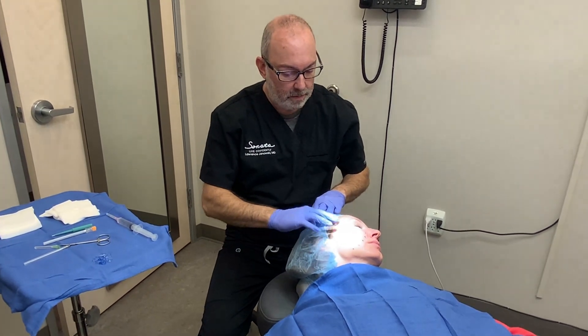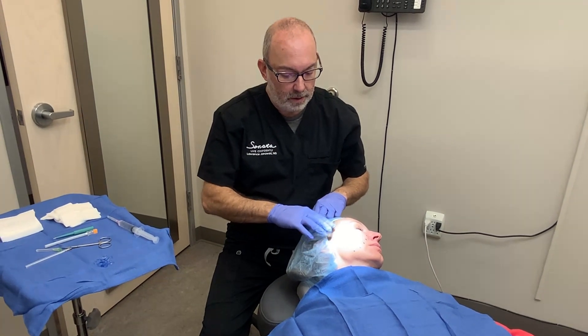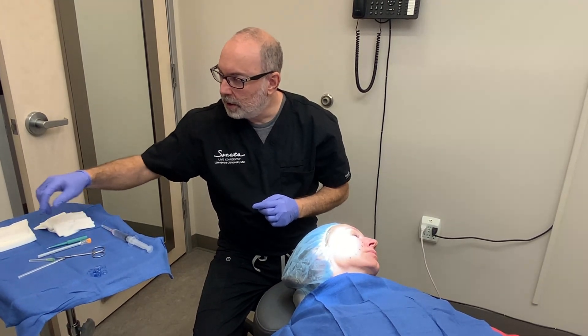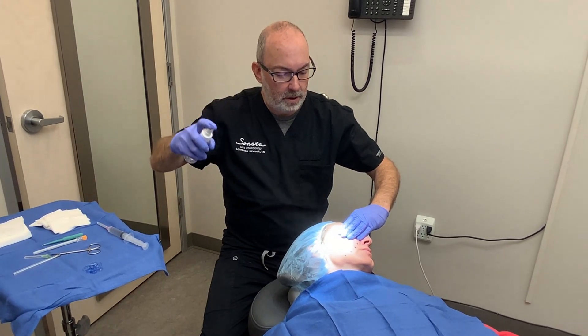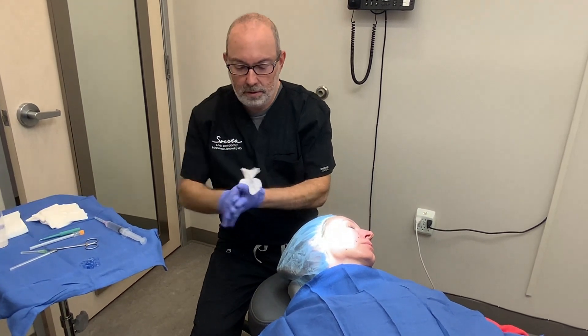I'm just going to use some ultrasound gel here to keep the hair matted down, and then we're going to spray the face with another cleanser, the hypochlorous acid, which is just an extra sterilizer.